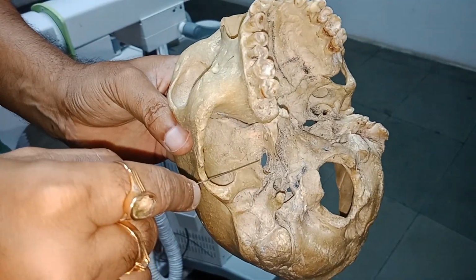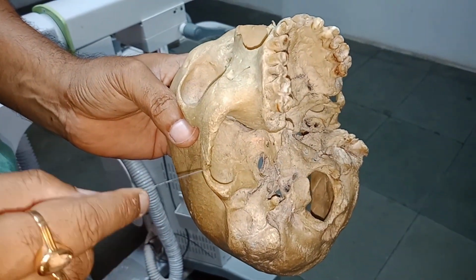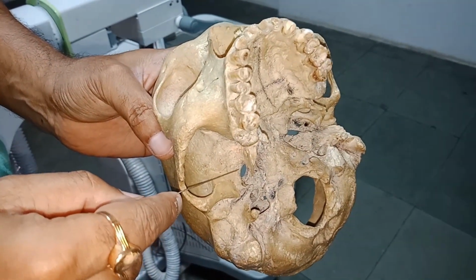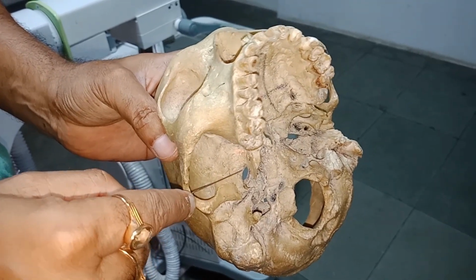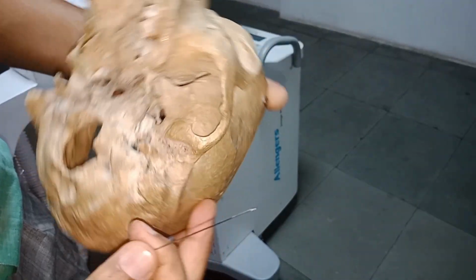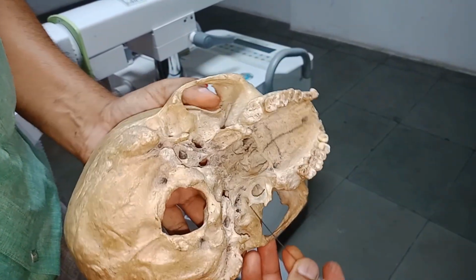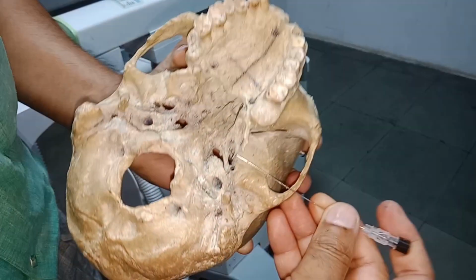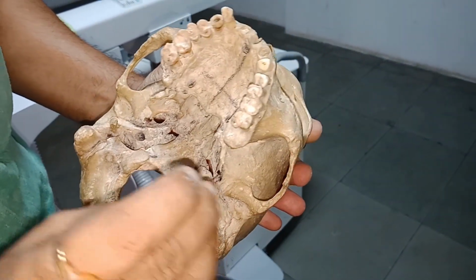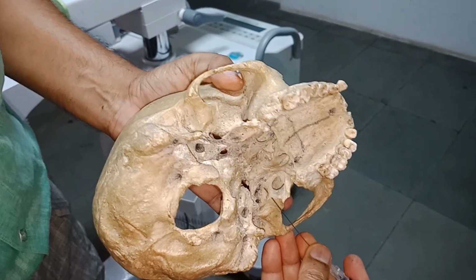So in the fluoroscopic view, if I see the lower border of the zygomatic, my needle is just at the level of the foramen, just about to enter it. You can see this is the foramen. So this is the level of the zygomatic.